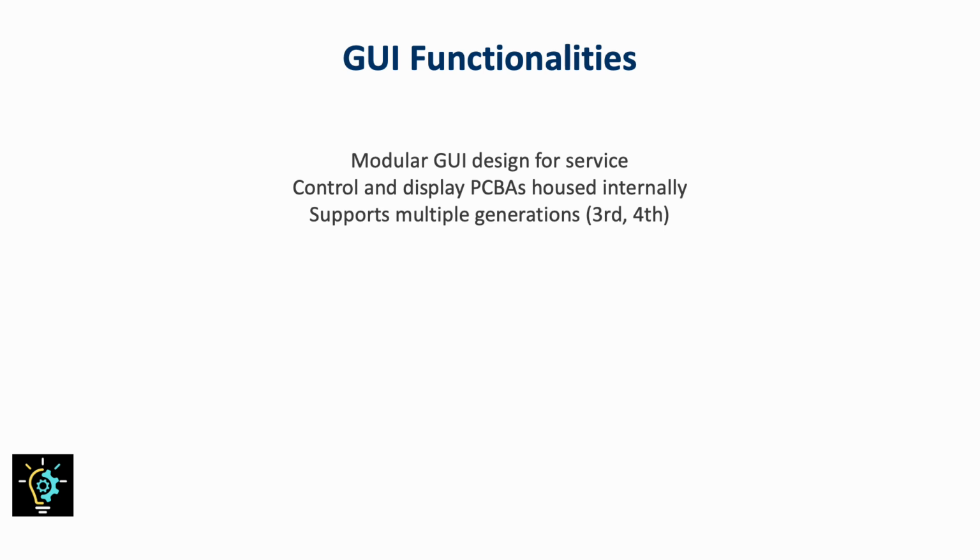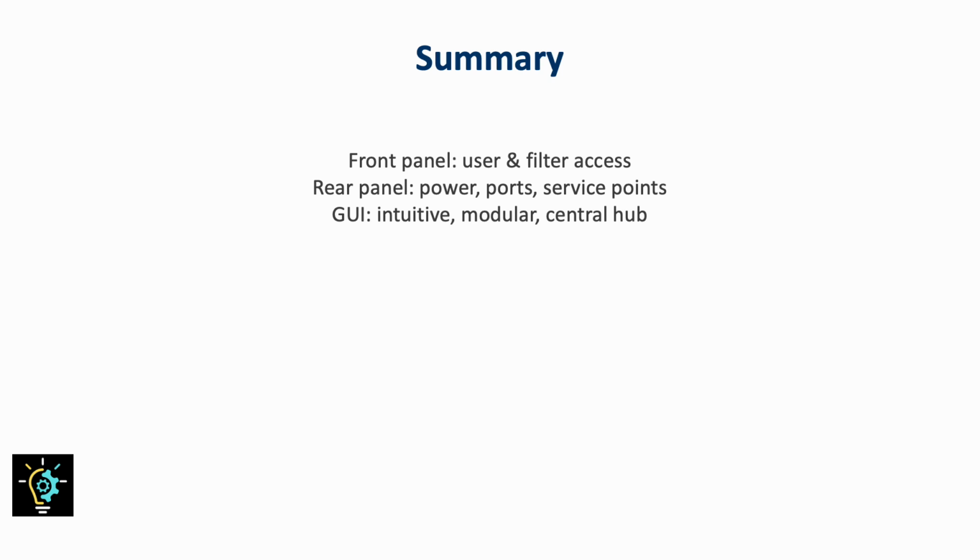For service engineers, this modularity means easier troubleshooting and targeted repairs. For clinicians, it ensures that the GUI always feels up to date, responsive, and reliable. It's a perfect example of how thoughtful design in medical devices isn't just about aesthetics, but also about long-term sustainability and adaptability. So let's wrap this up.